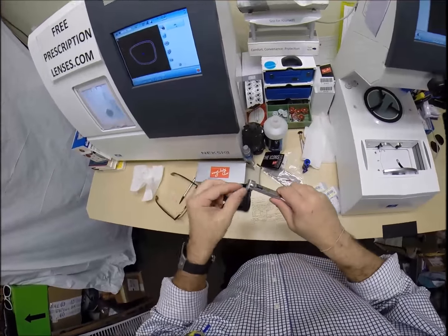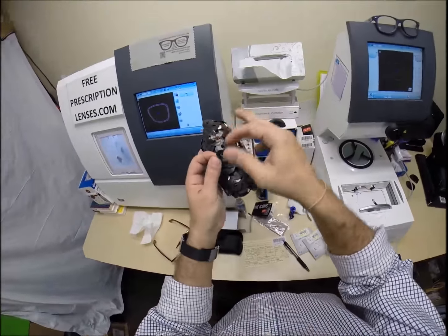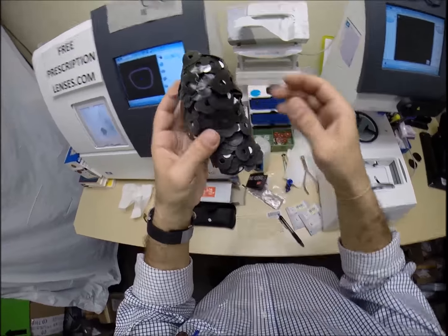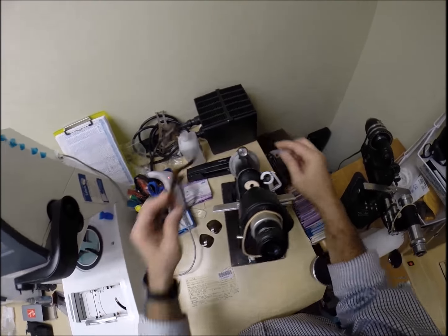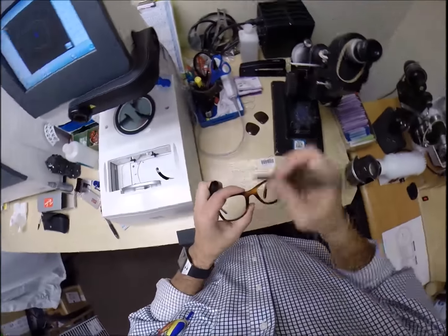I'm going to take this block off, dry that off, throw it in there, keep working on my artwork. They're starting to separate, so I'm going to see if I can connect those and press it back down. Let's come down here to the lensometer. We're going to spin the fine-tune knob back to 180, which is 0. Put it in above that black dot, which is hard to see, so I'm going to darken that.